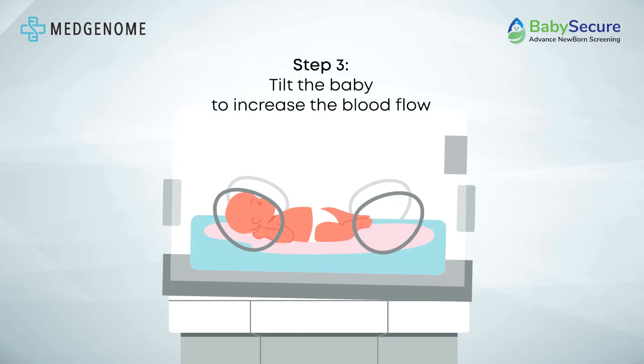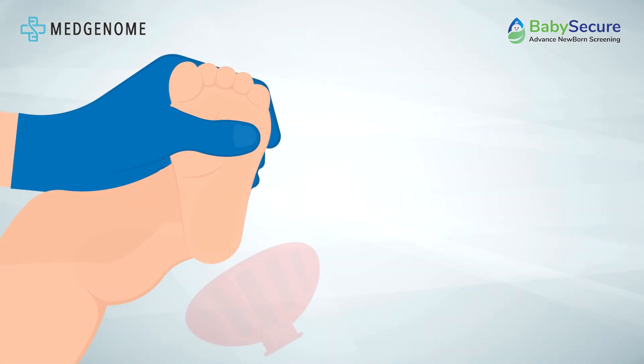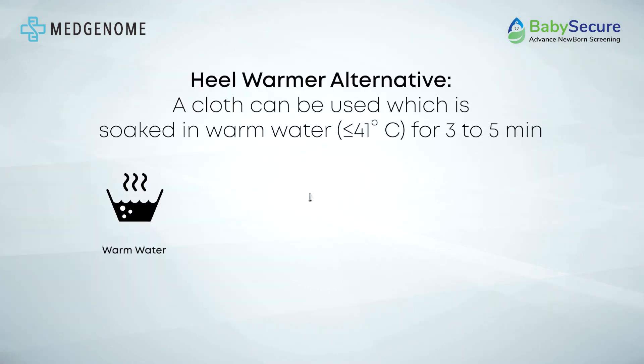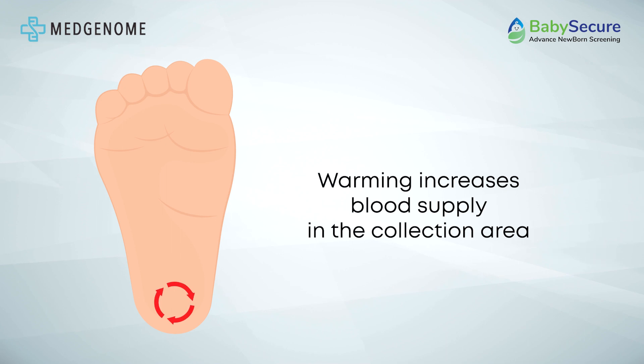Position the infant's feet below their heart level to optimize blood flow before beginning the sample collection process. Gently warm the infant's heel using the provided heel warmer, or a wet cloth soaked in warm water for 3 to 5 minutes with a temperature not exceeding 41 degrees Celsius. Warming the heel increases blood supply to the collection area, aiding in the sample collection process.